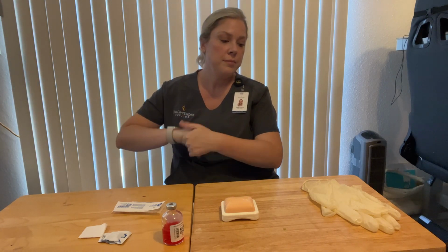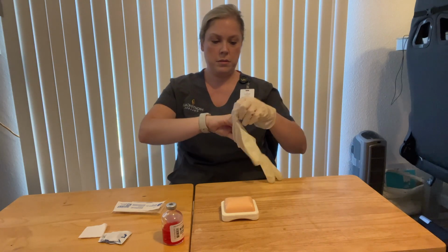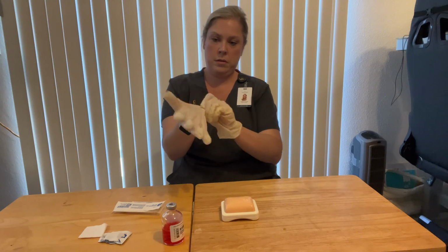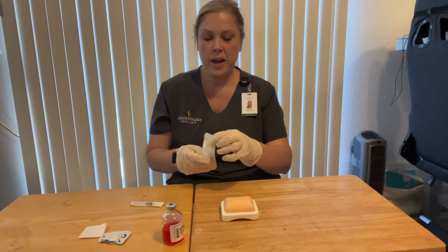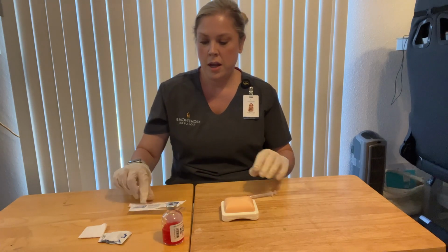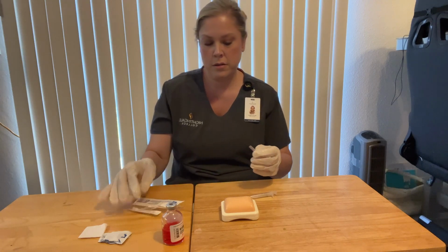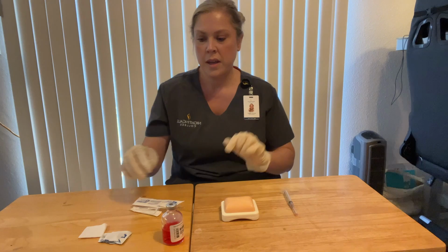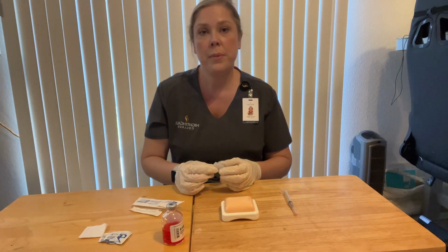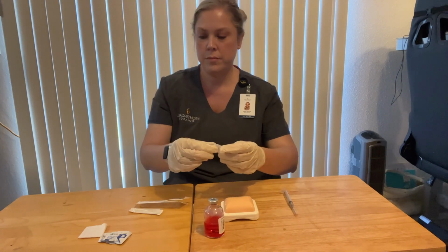Okay, perfect. I would go ahead and perform hand hygiene, apply clean gloves. I would then want to verify I had the correct syringe and needle. So I have a 3 ml syringe and a 22 gauge 1-inch needle today. I would attach my needle to my syringe. I would want to then grab an alcohol prep pad and clean the top of my medication vial before I withdraw any.